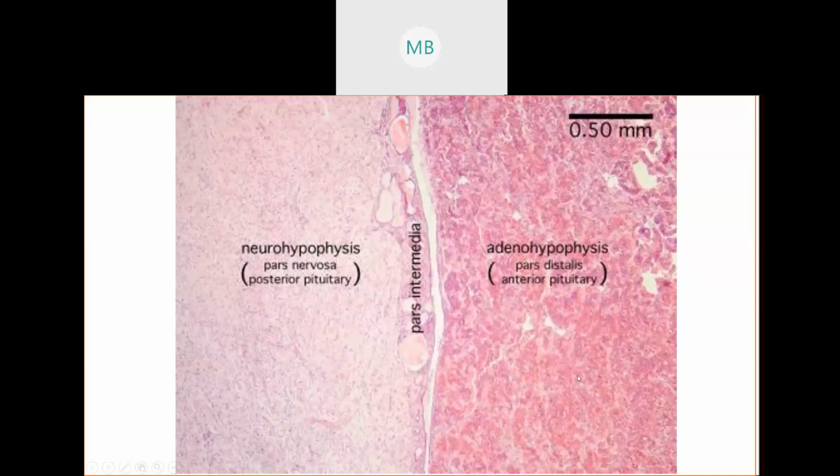Because of this, when we have sliced your pituitary, put it on a microscope slide and dyed it so we can easily view it, your posterior pituitary, whose fancy term, if you remember, is the neurohypophysis, because hypophysis is pituitary and neuro is the posterior part, since it is closer to the hypothalamus and the tissue is more neural, ends up looking light pink and more spacious, as opposed to the anterior pituitary, which has more densely compacted cells and ends up a hotter, deeper, richer pink.